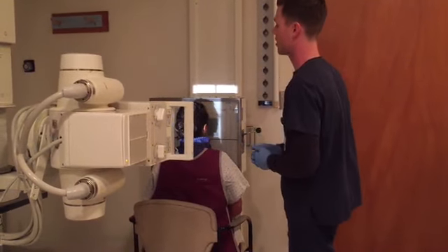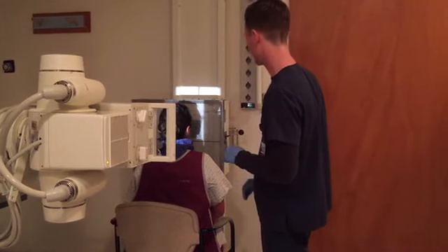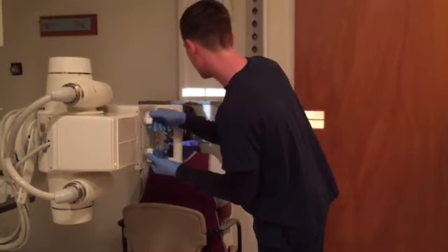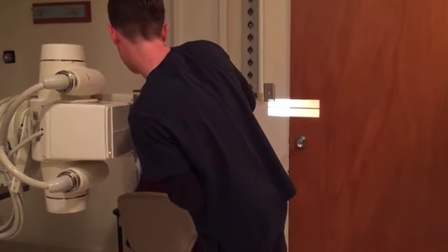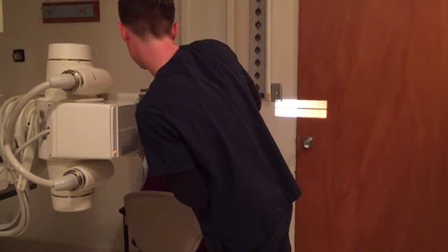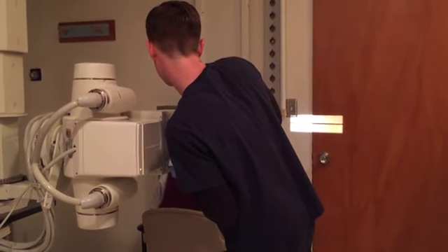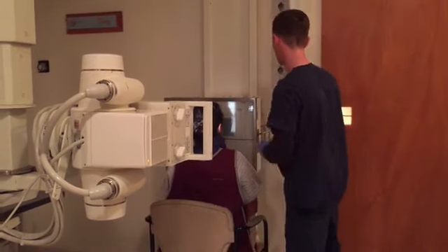You'd also ask to make sure the patient's not wearing any facial jewelry, no pins in their hair or anything. Got my 8x10 cassette in here, so I'm going to collimate down to that. I'm also going to make sure my bucky is lined up.